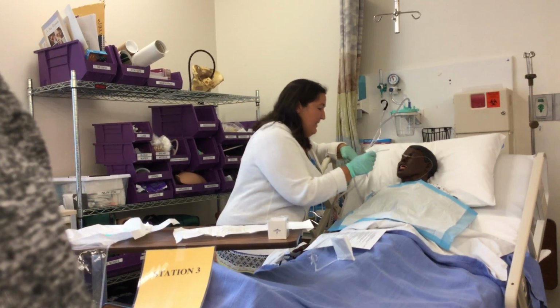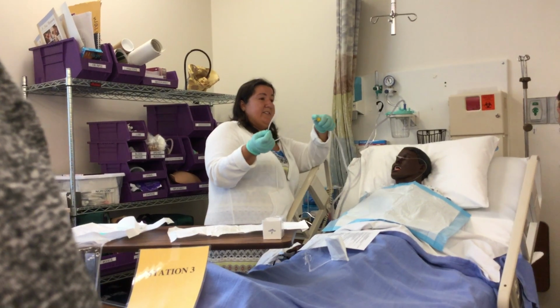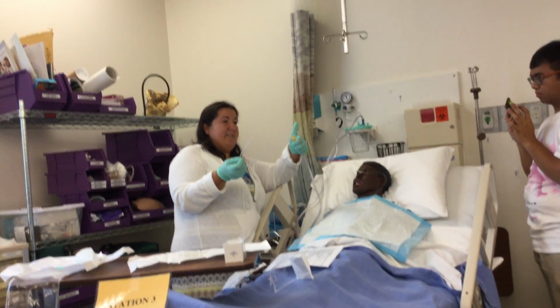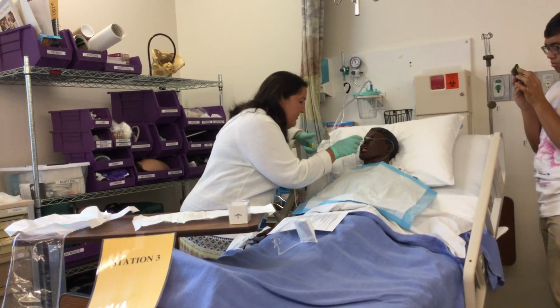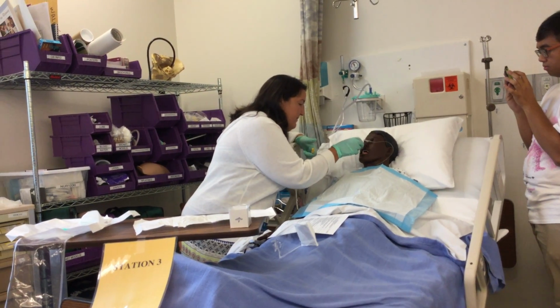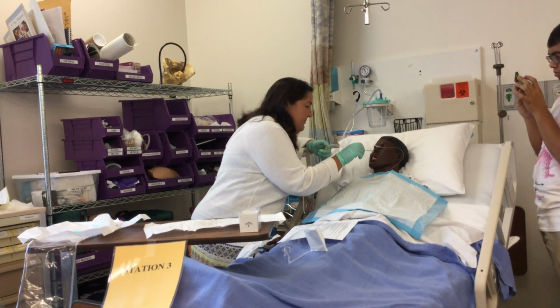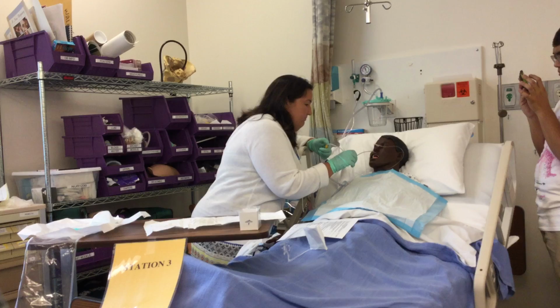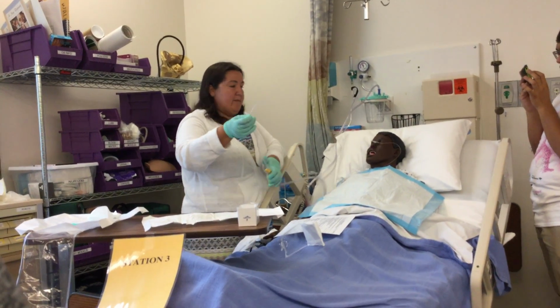And so you want to take your catheter. I'm going to keep my finger off. So this is not suctioning. This is suctioning. This is not. Now it's not doing anything. So I'm going to go in gently. And then you're going to kind of meet resistance. And then you want to suction back. And you want to go like that. So you want to come back. And then you kind of want to give them a break.